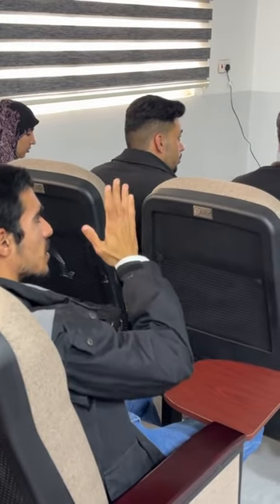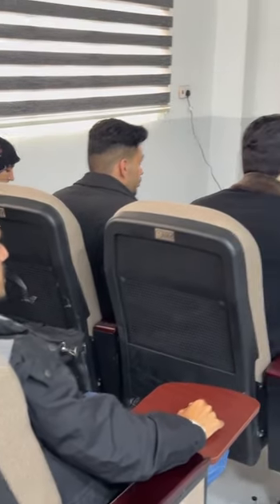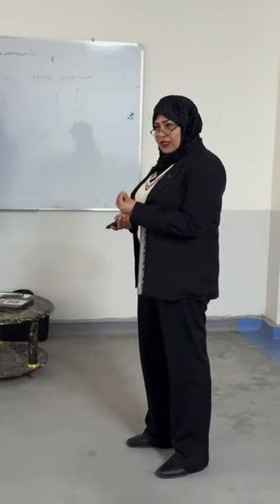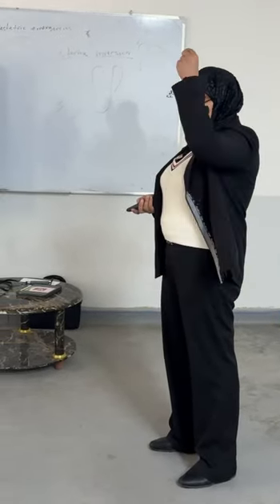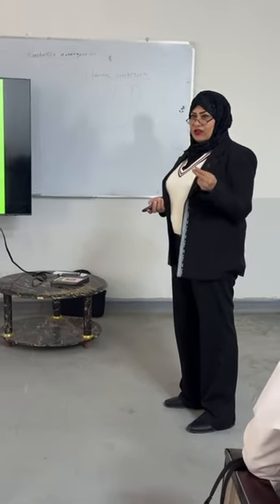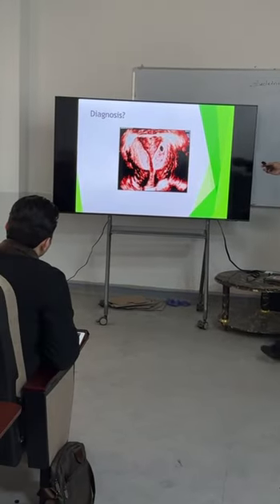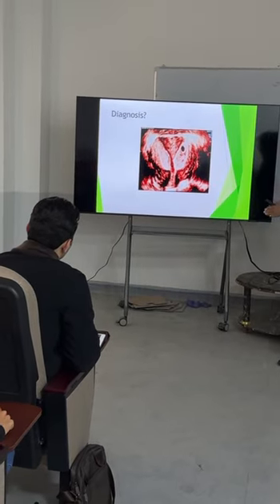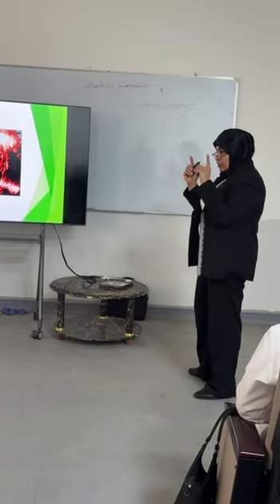Transvaginal ultrasound shows the uterine cavity with intact fundus and a septum descending from the upper part of the uterus down to its cavity, suggesting a septate uterus. It separates the cavity into two parts, but not the uterine body, just the cavity.